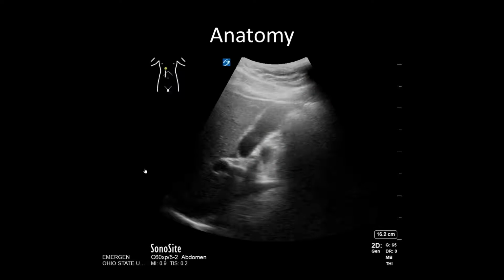First, we'll review some gallbladder anatomy. The gallbladder is anechoic and fairly superficial and resides just inferior to the liver, noted here as a hypoechoic landmark on the leading edge of the probe and the cephalad portion of the body. The portal vein is just deep to the gallbladder and also anechoic with hyperechoic walls. The duodenum is just deep and inferior to the gallbladder. This can often be confused for the gallbladder when there is fluid within the duodenum.